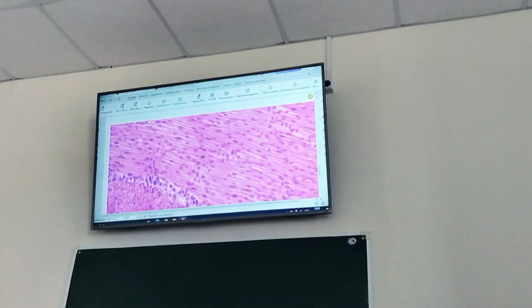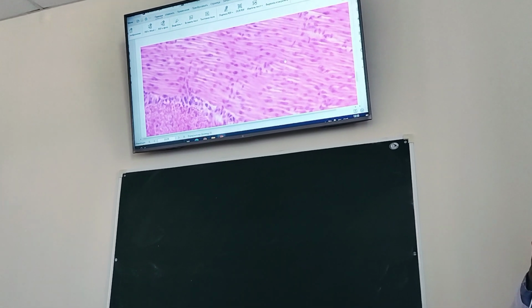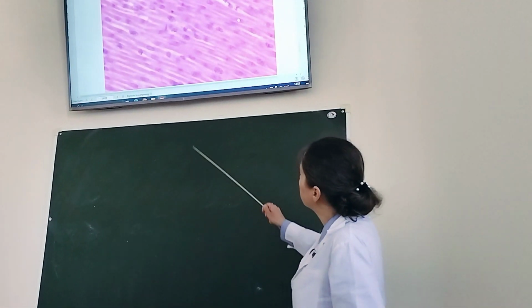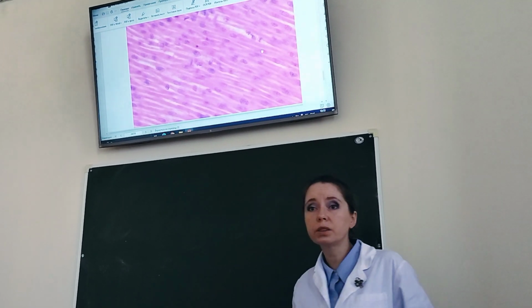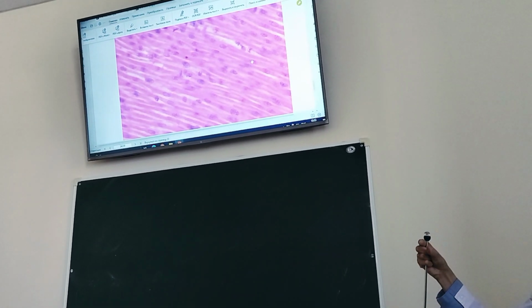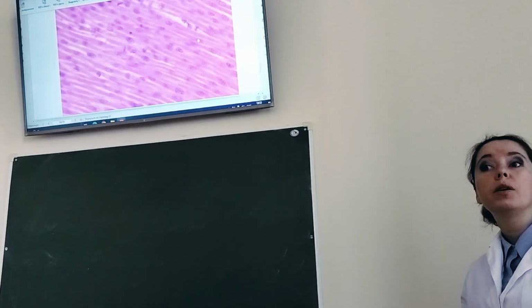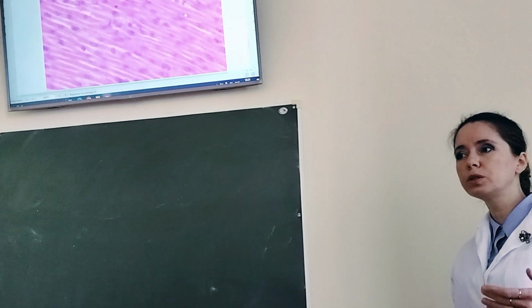And this is one more case of muscle. Smooth muscle. Primitive description: smooth myocyte, a structural and functional unit. If I show you in high magnification, I can define a smooth myocyte, which is a mononucleated cell, very elongated with spindle shape, generally spindle-like morphology, and a centrally located elongated nucleus, without striations, so a smooth appearance.